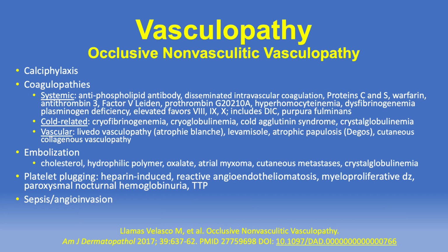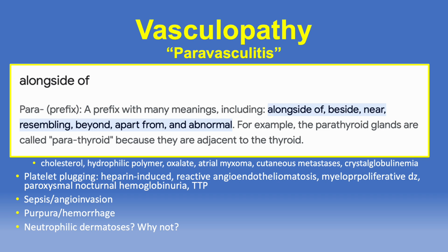More recently, Mar Llamas Velasco from Madrid, Spain, and colleagues have produced a detailed review of vasculopathy under the heading of occlusive non-vasculitic vasculopathy, which is a longer but more explanatory term that essentially comprises, in my mind, all of vasculopathy. So we see the same categories that have been listed under pseudovasculitis and vasculopathy by others, but this is a very detailed list that can come in handy when encountering such a case and needing to generate a complete differential diagnosis. I also recently saw a program in which Dr.